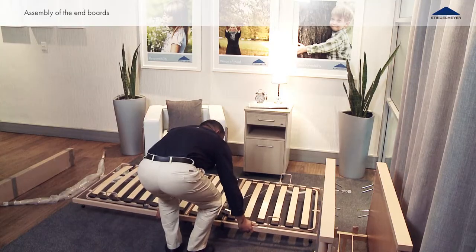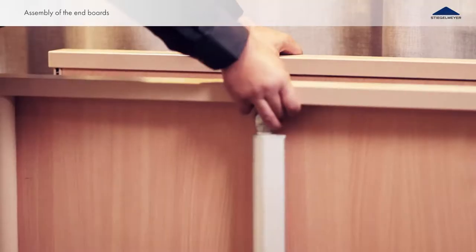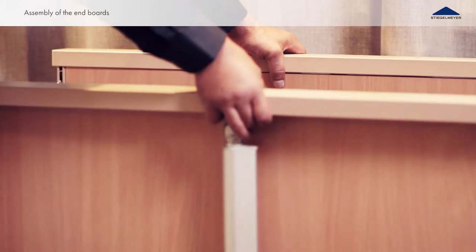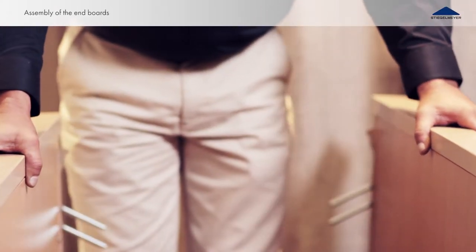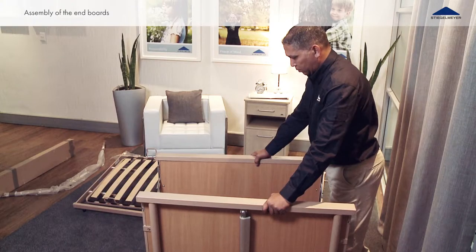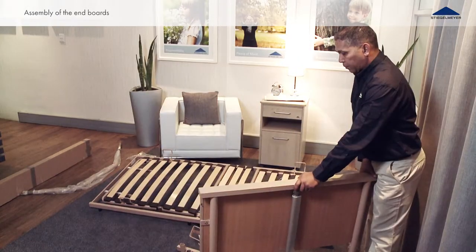Place the combined reclining surface frame flat on the floor. Disengage the head and foot boards, pulling them away from each other. Place the headboard to one side for the time being.